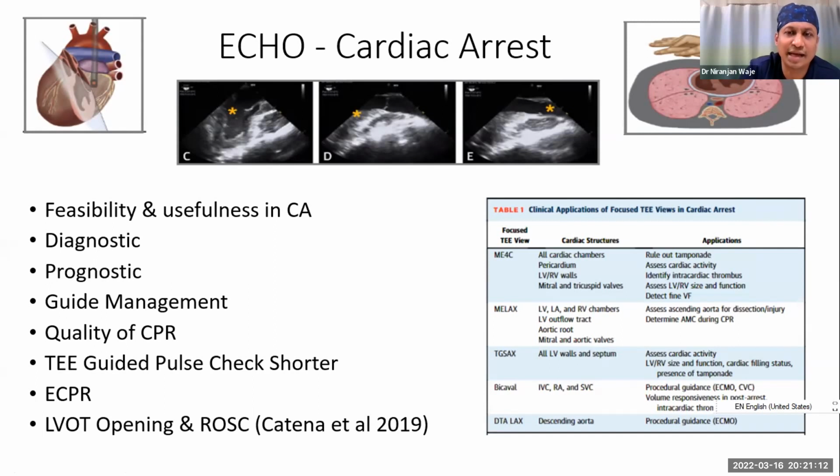Not only that, it can also be of diagnostic utility, as we have seen. If you see a lot of collection around the heart, it can help us to identify tamponade, and accordingly proceed to a good outcome. It is a prognostic indicator as well.